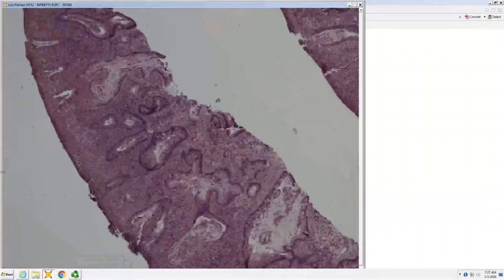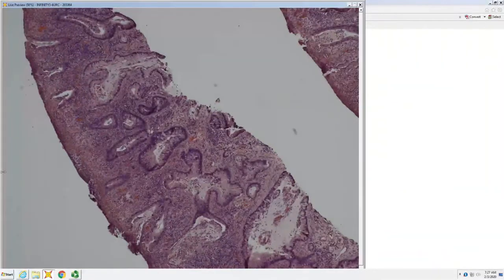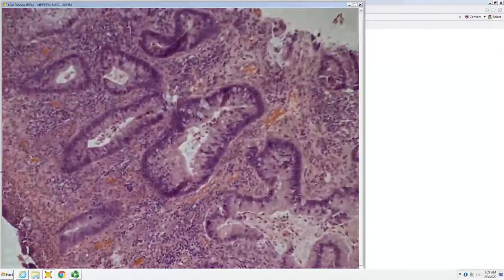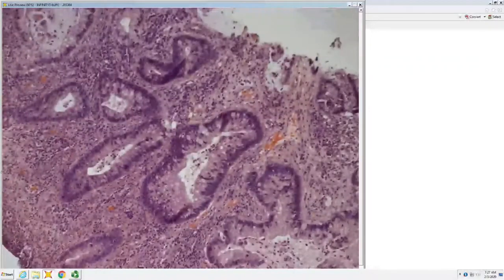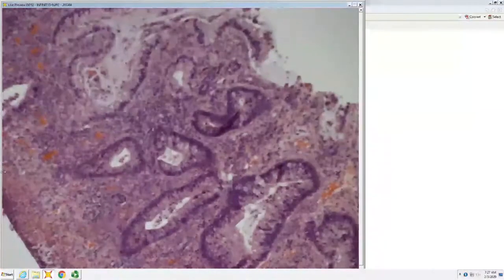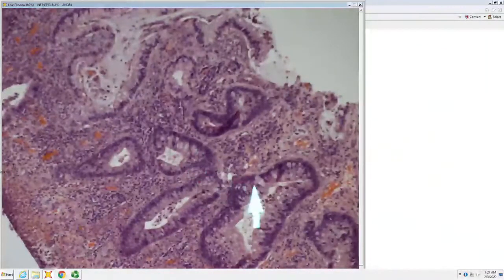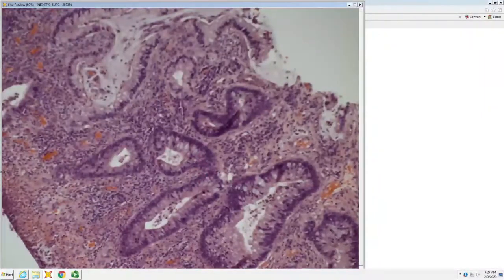Okay. This is one that's a little more recognizable. So, Dan, you want to jump in for this one? Yeah, sure. Definitely glandular. It sort of resembles colon. There's a lot of inflammation, some necrosis, a lot of goblet cells. It's a columnar epithelium, goblet cells, dirty necrosis, inflammation.